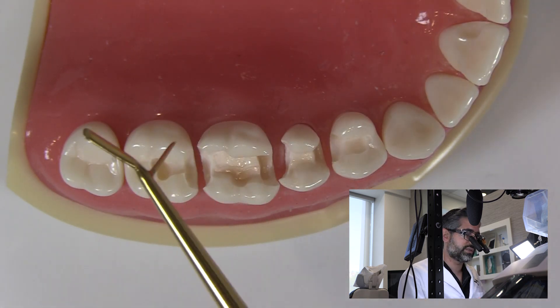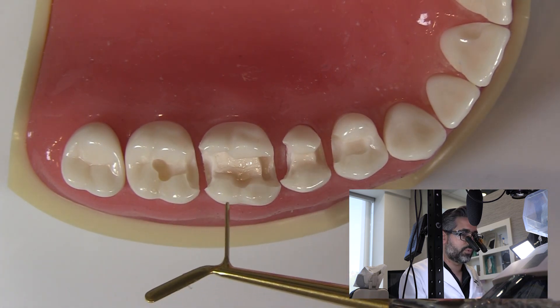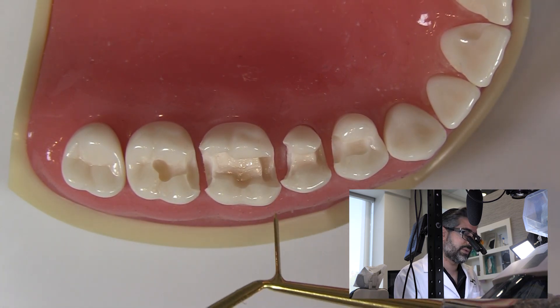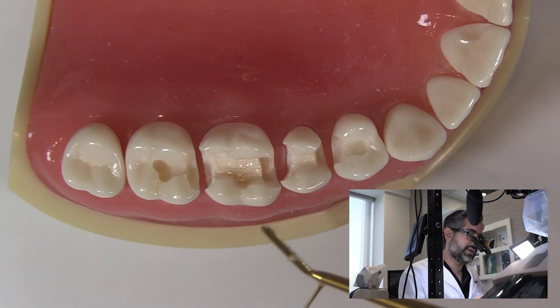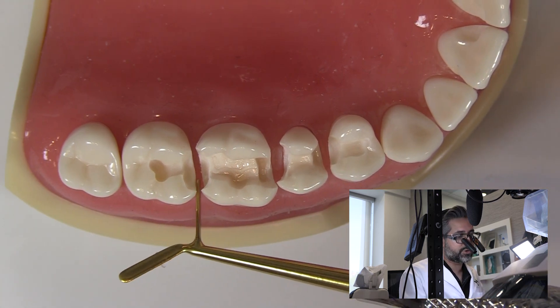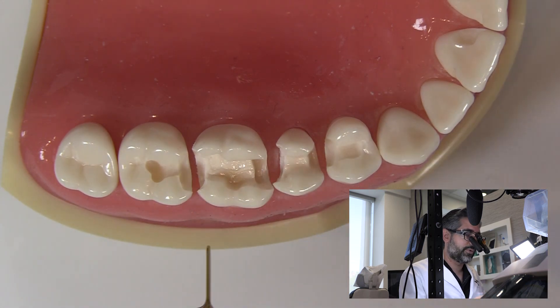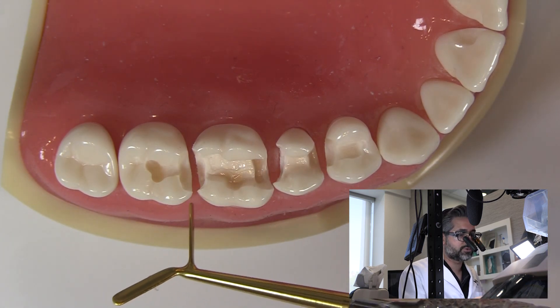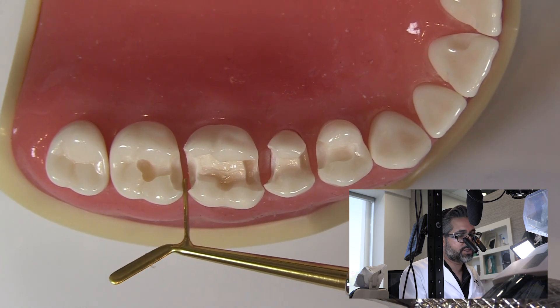So I'll finish the most distal tooth first and work my way forward. In this case, I'll be restoring this tooth here, placing my matrix band, finishing that, then moving on one by one working my way forward, because I have the best access for the one in the front. I don't like to do them all with the matrix band at the same time — to get the perfect result, I really want to make sure the contact and the contour are under my control.